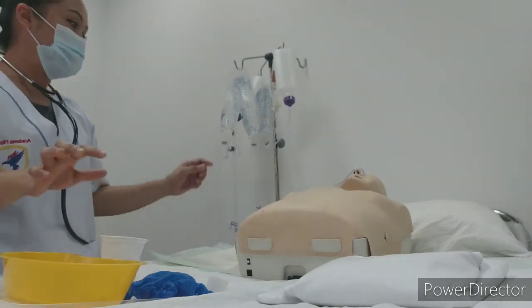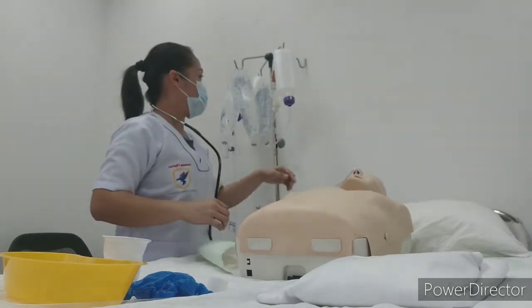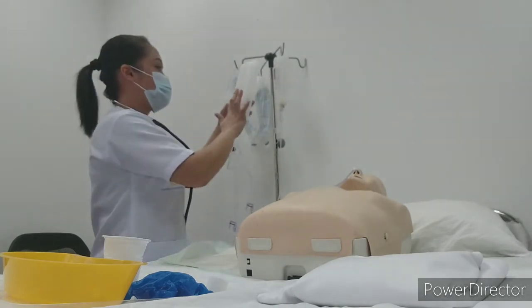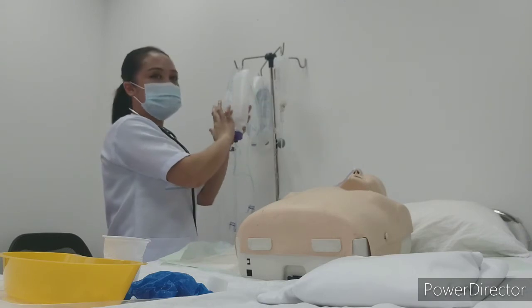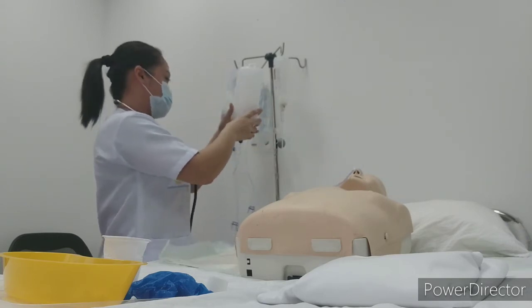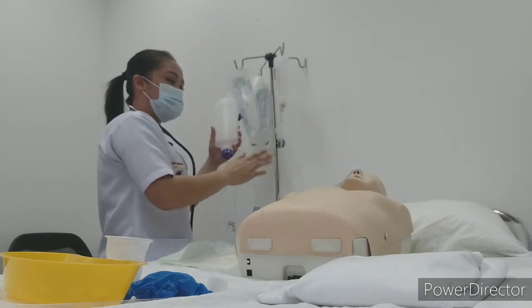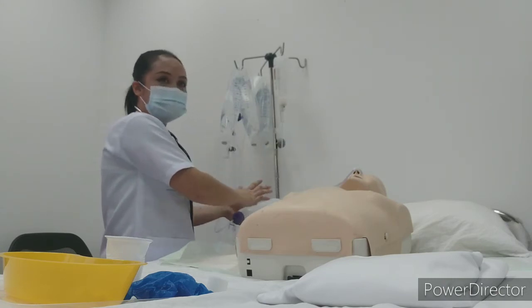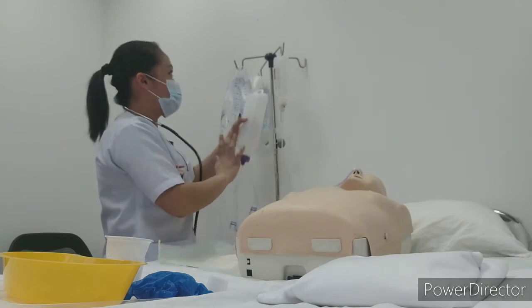So now we are doing the second feeding. For the second feeding, we have this 1000 ml or 1 liter. So you need to check the complete name of the patient and the expiration date of this one. This bottle you will take from the fridge. So make sure 10 minutes before you feed the patient, you need to remove this one and then set aside. Take a towel, set aside. So now it's okay, we will hang this one.